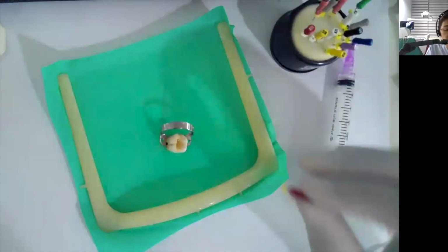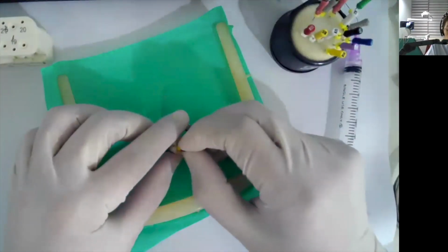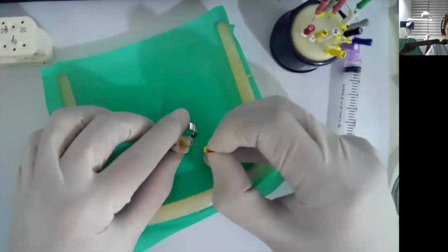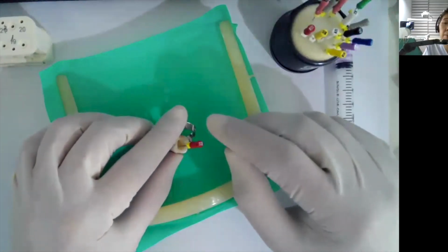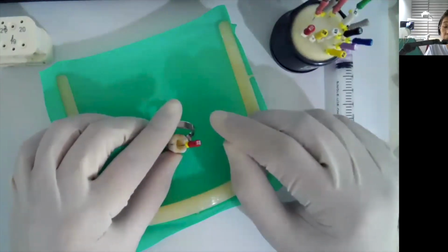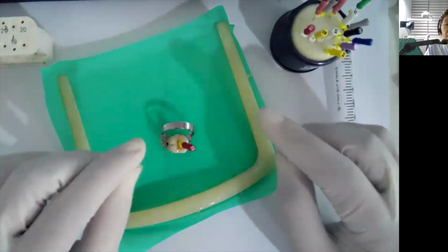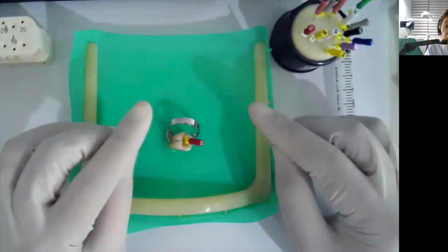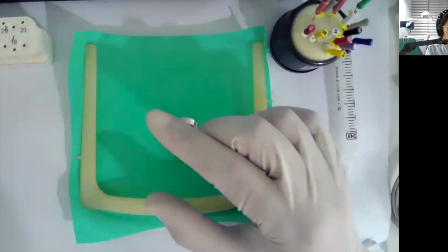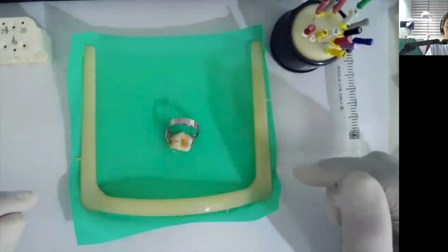Please make sure that each of the canals will have the apical stop. And what is the importance of that? When you do your obturation, then you will have a better tug back and avoid extrusion of the gutta percha during obturation. So this will be the end of my presentation for the table clinic using the glide finder as well as the RT files. With that, thank you very much.